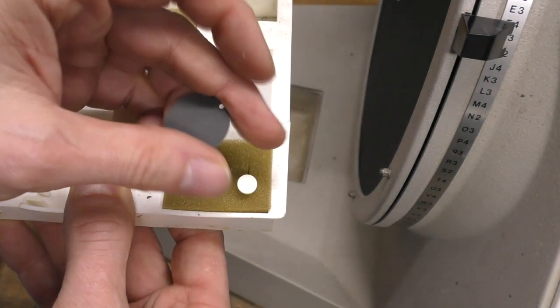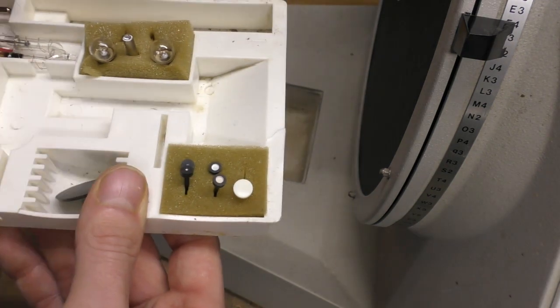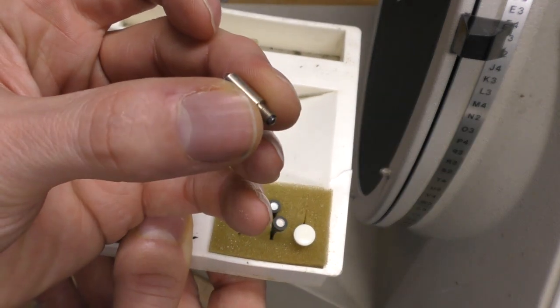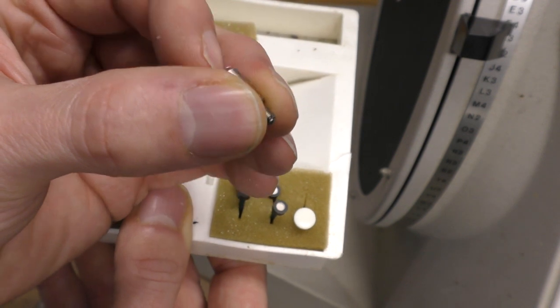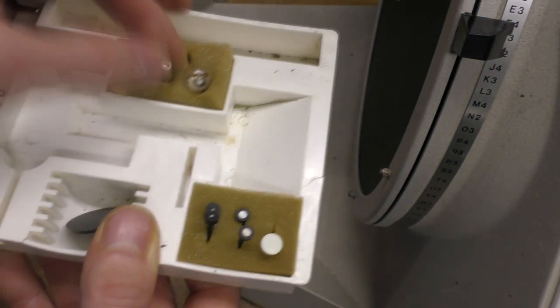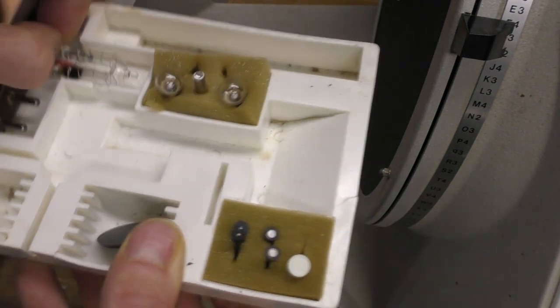One that can be rotated, provide sort of different offsets. Some spare bulbs, including this rather interesting looking bulb. It's got a fairly precision machine screw thread on the bottom and a very small lamp at the top. Not quite sure what that one's for yet. And a replacement flash tube assembly.